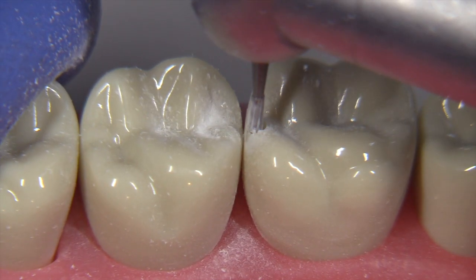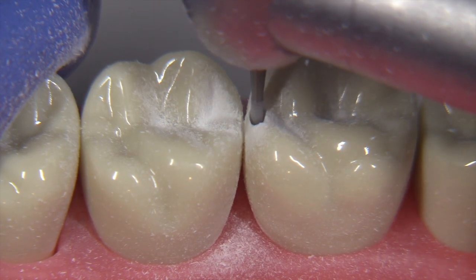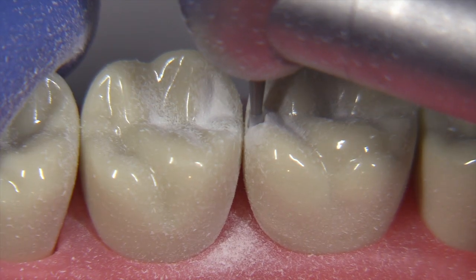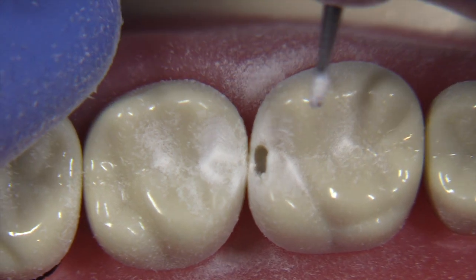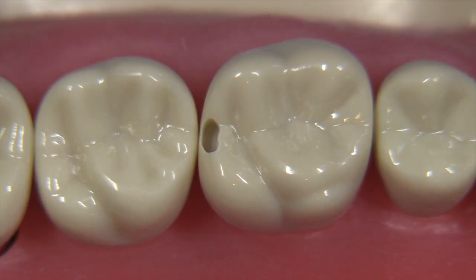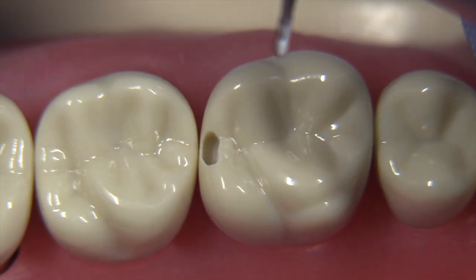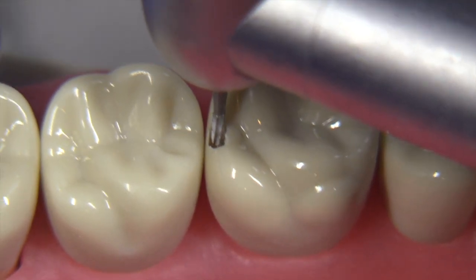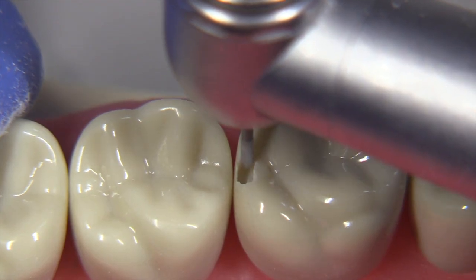You can confidently drop the 245 bur the entire length of the flutes because we're rarely going to break contact less than that. Then we can move the bur quite easily without any fear of hitting the adjacent tooth by leaving a little shell that's probably about 0.2 millimeters wide. We can move the bur buccal-lingually and get a little slot going, centered on the contact. You can then make it wider by starting at the top of the wall and chopping your way down.